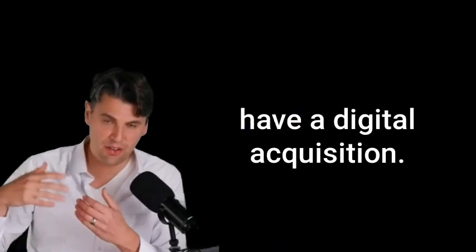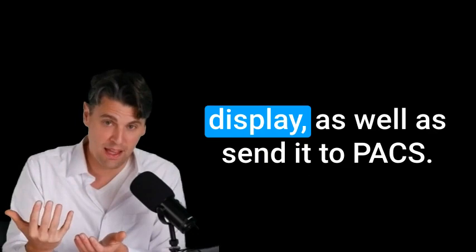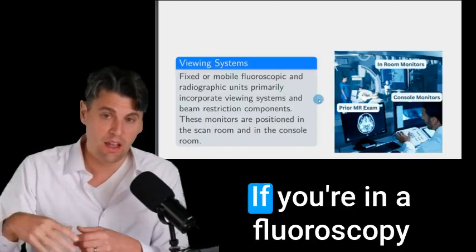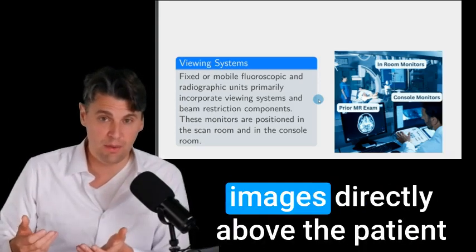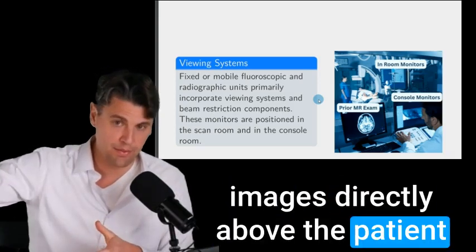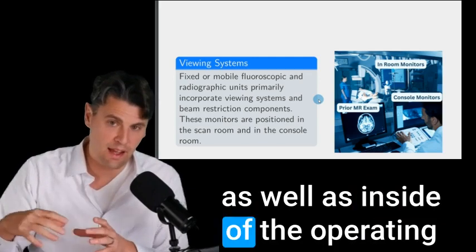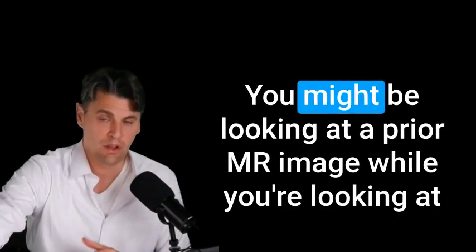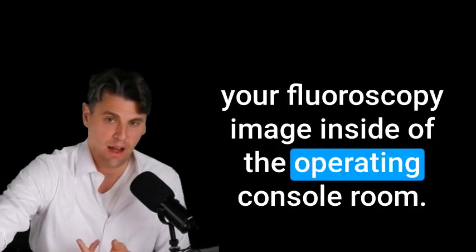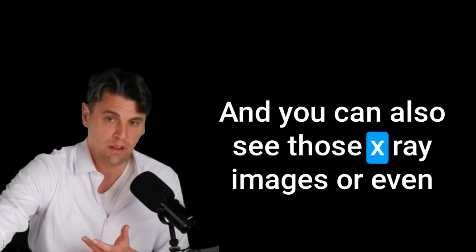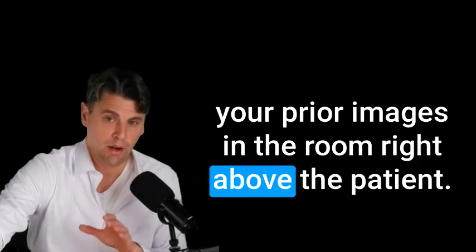So after you've taken the acquisition, you have a digital acquisition, then you want to look at that acquisition on your display, as well as send it to PACS. If you're in a fluoroscopy setting, you will also typically have the ability to visualize those images directly above the patient so that you can see them as you're working as a clinical staff as well as inside of the operating console room. You might be looking at a prior MR image while you're looking at your fluoroscopy image inside of the operating console room. And you can also see those x-ray images or even your prior images in the room right above the patient.